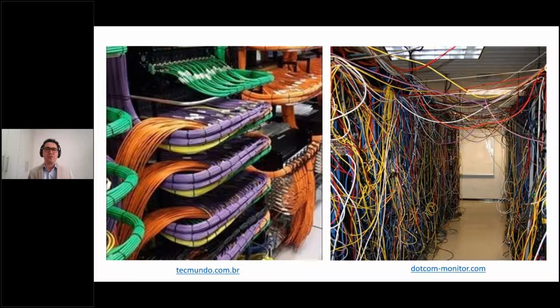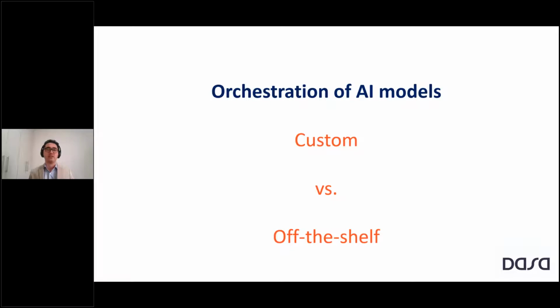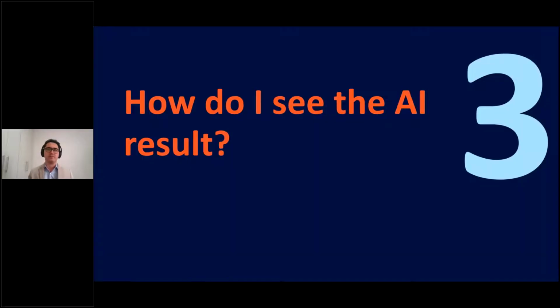And all the maintenance, all the IT infrastructure that is needed, if you have a separate infrastructure for each company you deal with, I think that's something that is not scalable. And I'm not even considering having a separate agreement and contract with each of these companies that provide those models. So this makes AI orchestration important. Whether you're going to build your own orchestration platform in-house, or buy some off-the-shelf product, there are benefits, advantages and disadvantages to each of these. But we do need an orchestration platform to coordinate all those models that are going to be used.